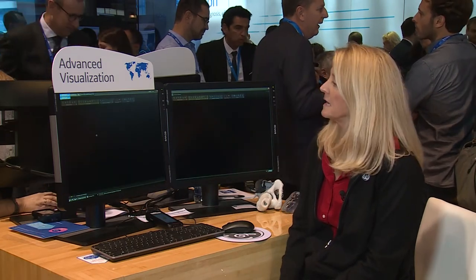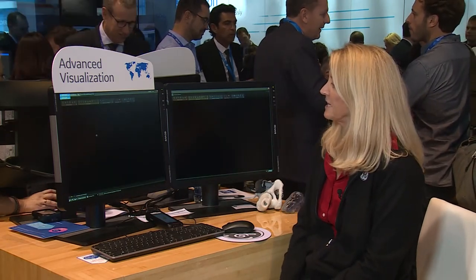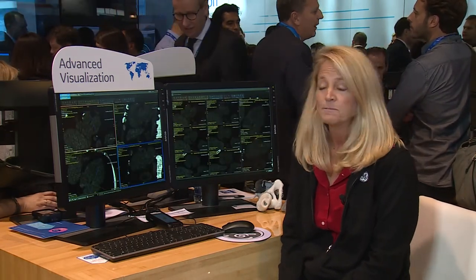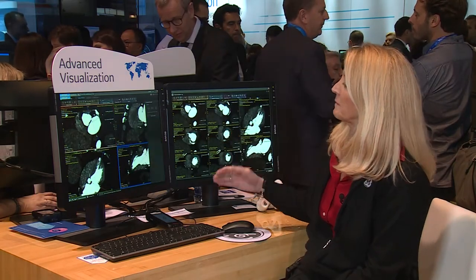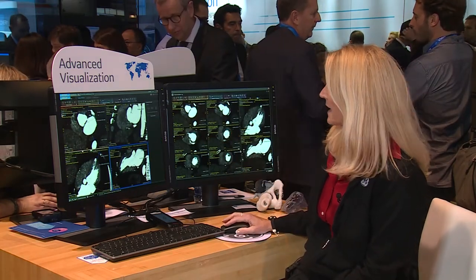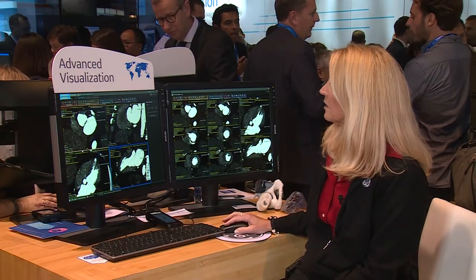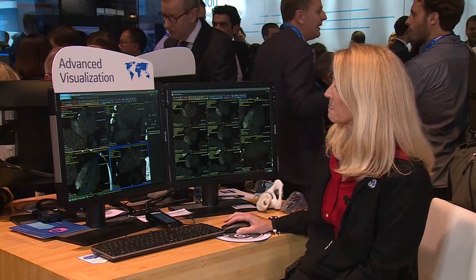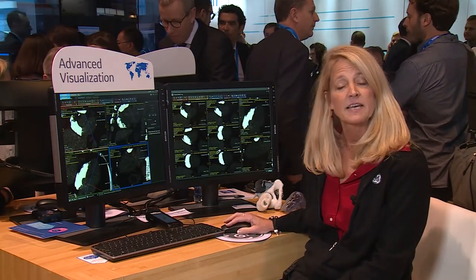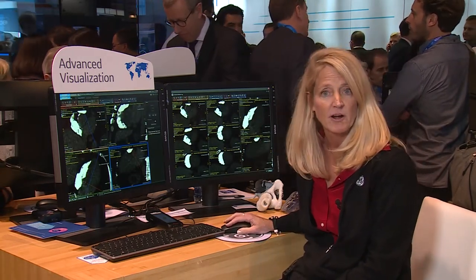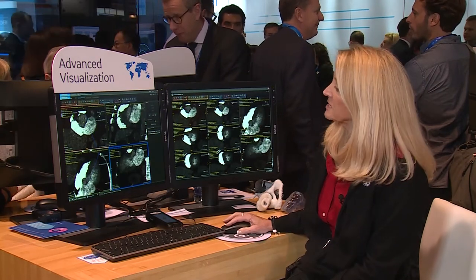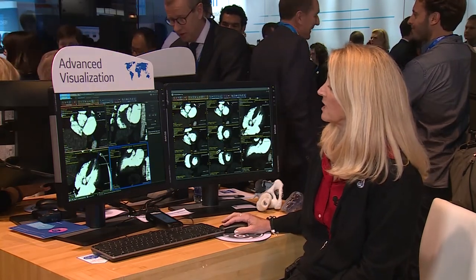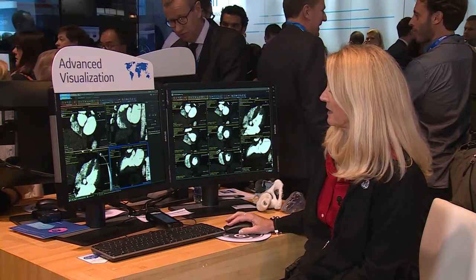When it loads, we're going to look at the Cardiac Reformat tab, Segmentation, and Functional Maps. In the Cardiac Reformat tab, when that opens up, we can go ahead and play it in a Cine Mode and we can look specifically at the myocardium and watch the contrast wash-in and wash-out in the myocardium.